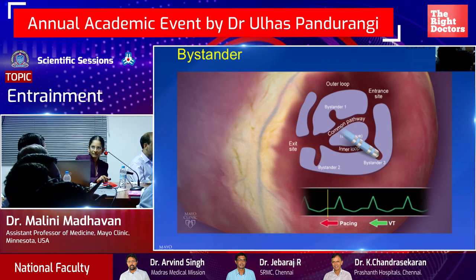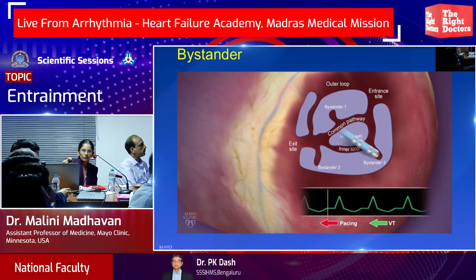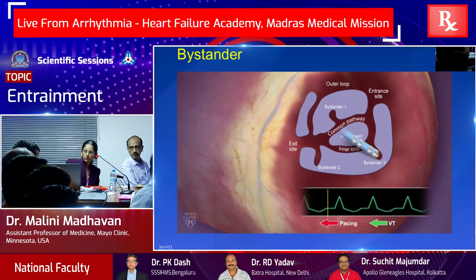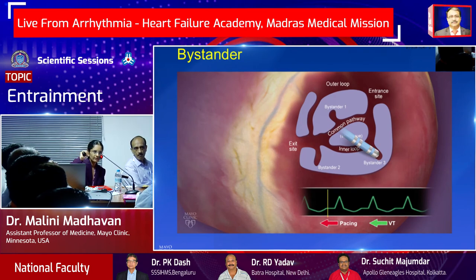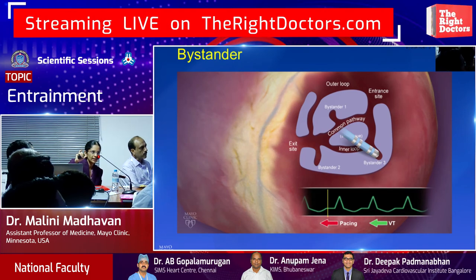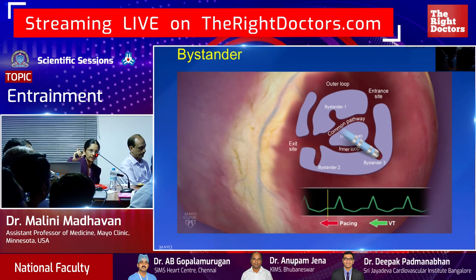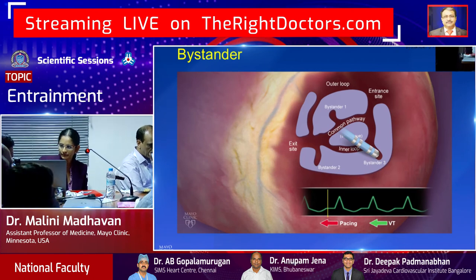Differentiating between inner loop and bystander will be stim to EGM, QRS and EGM to QRS. Yes, correct. It is quite confusing. But once you get this down, and I have a few tables too and I'm happy to share slides with the audience, once you do it in a few cases, it becomes much easier. You just have to have a mental picture of what a bystander would look like, and then look at what the PPI and the TCL would look like.